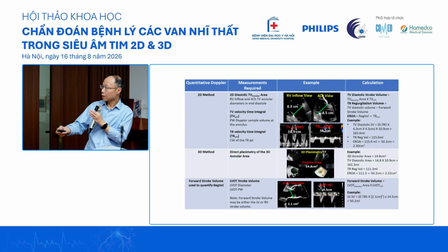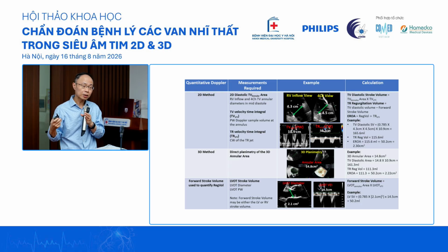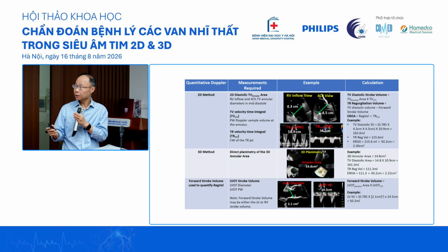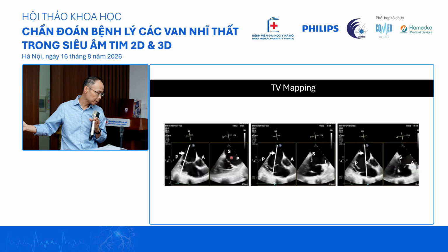I believe I just put it up as shared by Dr. Tran. We still make use of all these numbers to guide us to decide when the patient should be considered for a tricuspid clip. If you have all the numbers, you are confident. If you don't have those numbers, but the patient has, say, cardiac cirrhosis, pedal edema, high JVP, and repeated admissions for fluid overload, do not rule out a clinical severe TR just yet. Okay, and we have gone through this.